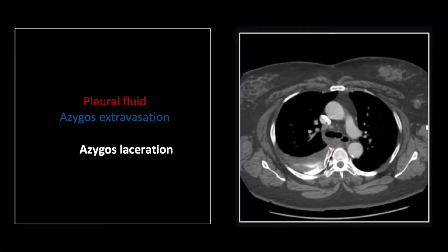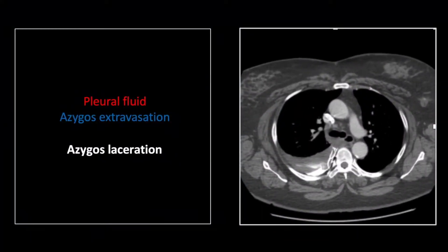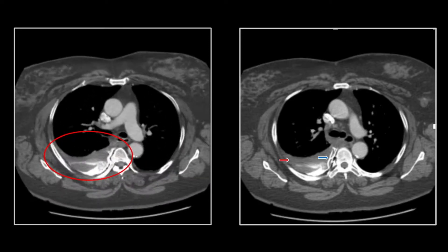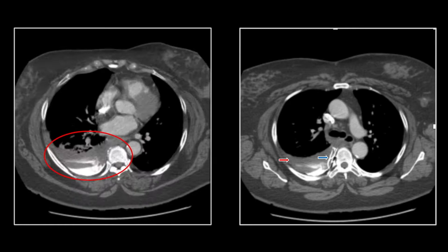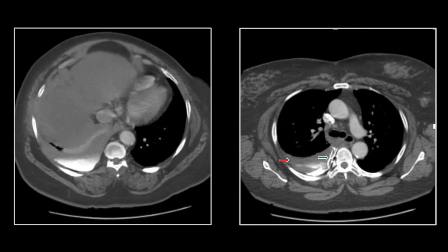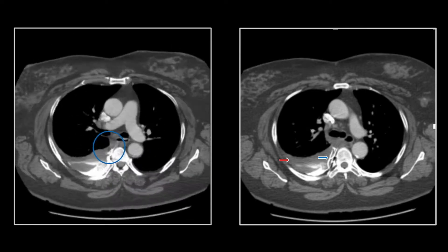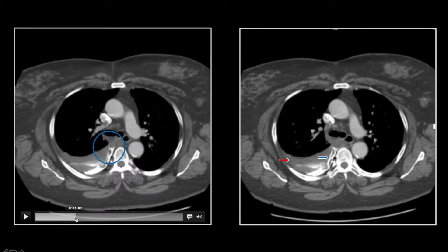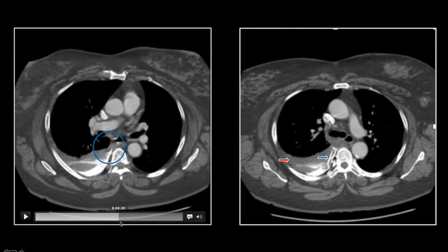Our next case is an azygous laceration. There is a large pleural fluid collection on the right with layering contrast, all extending from a contrast-enhancing azygous vein. The fluid collection with layering contrast and its source on the azygous arch can be seen clearly — there it is, actively hemorrhaging.